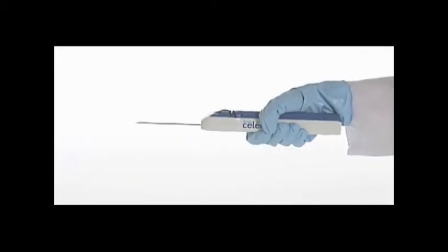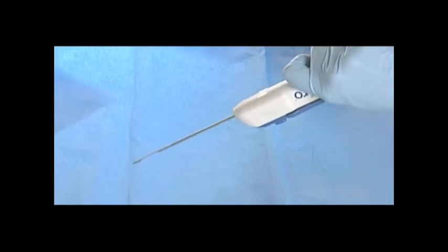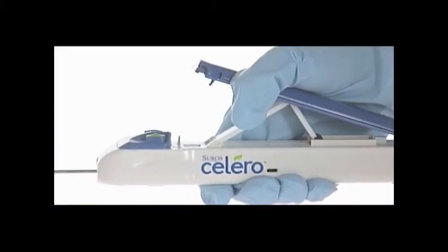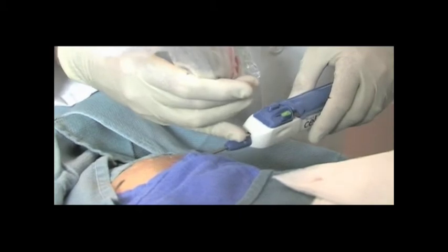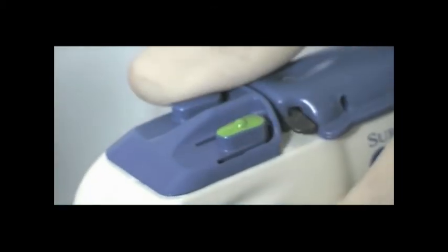Compress the actuating lever one time to prime the vacuum. Tilt the device 180 degrees and compress the actuating lever a second time to retract the outer cannula, exposing the tissue sample for retrieval. Once the sample has been removed from the aperture, compress the actuating lever to retract the inner cannula. You are now ready to reinsert the Solero through the introducer sheath to obtain another tissue sample.